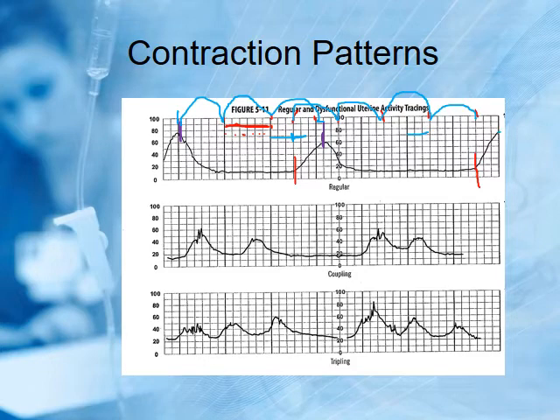This one, we're going to pretend that keeps drawing. Let's see how far apart this one is. So the peak is here. 1, 2, 3, and probably 4 minutes. Just like the same information we got going from beginning to beginning, we got going peak to peak. Okay, so she's contracting every 3 to 4 minutes.